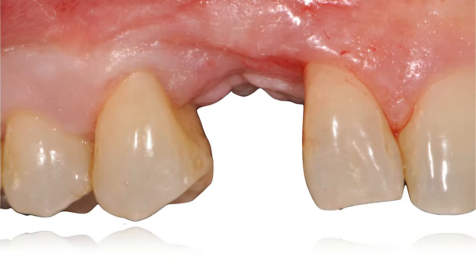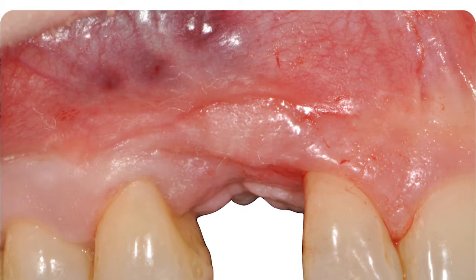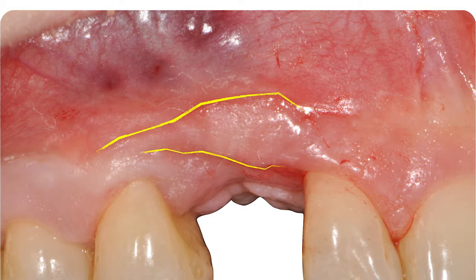This patient had a traumatic extraction of the canine, followed by a bone graft that failed, followed by another surgery with simultaneous bone grafting and implant placement that failed again. She's showing, of course, mucogingival deformities here. We can see that there is also recession on the neighboring dentition. They look like minor recessions. The lateral incisors had mobility class 2.